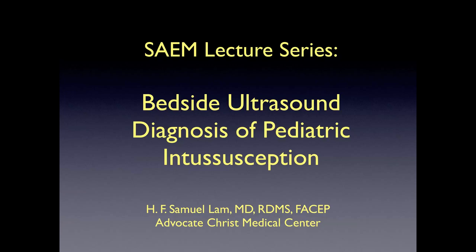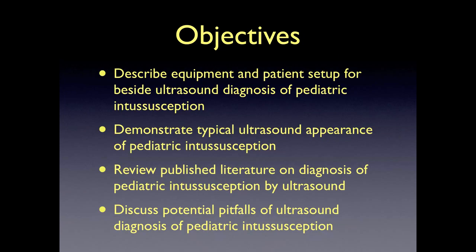Hello, my name is Sam Lam, and the title of the lecture is Bedside Ultrasound Diagnosis of Pediatric Intussusception. And these are the objectives of the lecture.